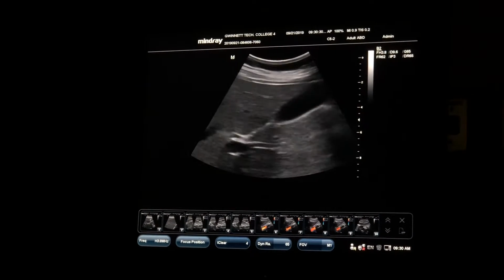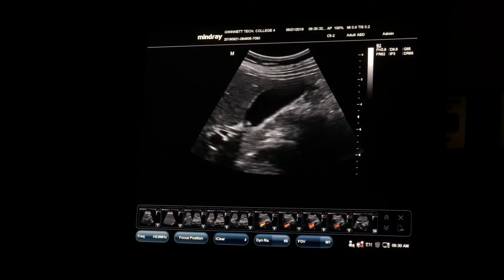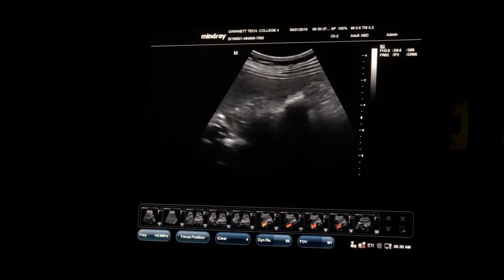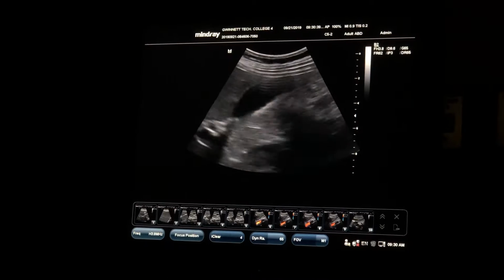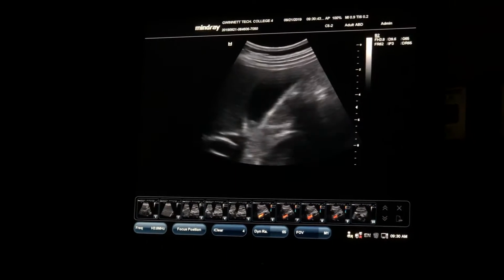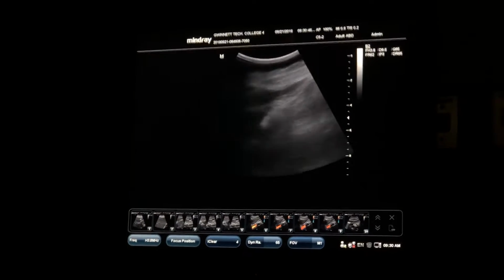So that's what using multiple windows is for. So I came down here. I'm just down here now, I'm at her ribs, and I'm waving through with my probe. I'm doing the same little fanning technique. I'm scanning out, I'm scanning in. Now I can see it. I'm oblique, I'm down here. You can see where my probe is. So I started up here.